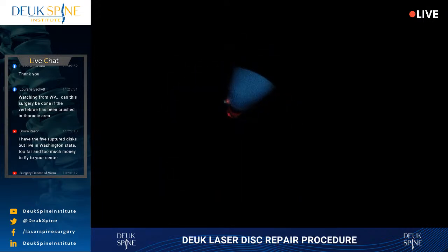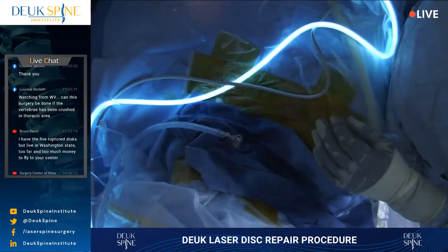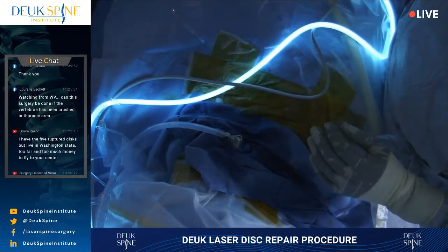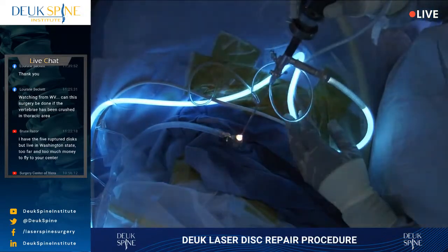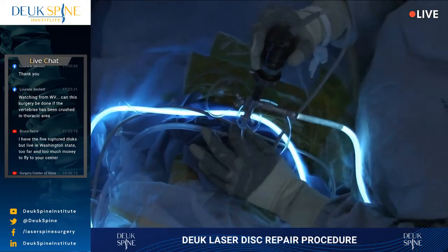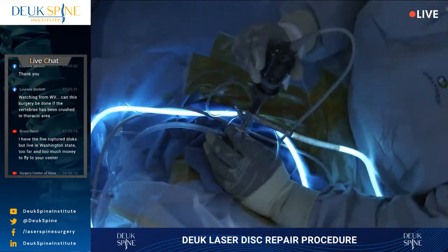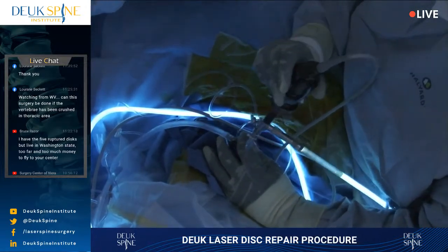So if you want my opinion, just fill out the free MRI review and I can do that for you, but I've got to see your films. Just use one at a time, okay, not two. And use the middle surface of it so you capture the disc, and you can clean it off and send it later for the pathology. Okay? Be smart about what you do, how you work. She says thank you. You're welcome.